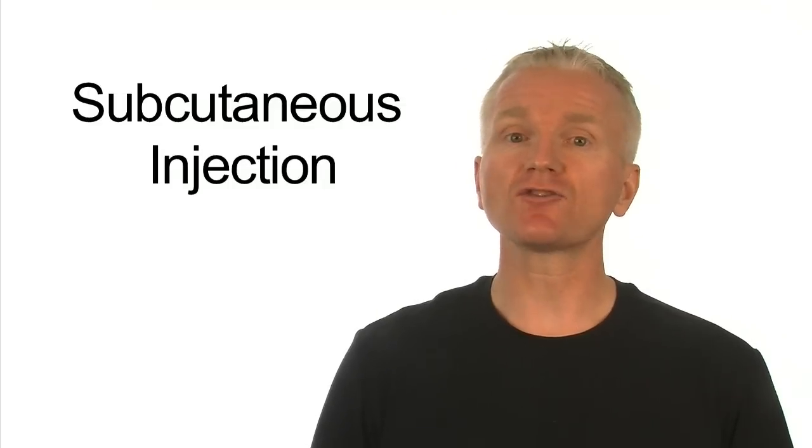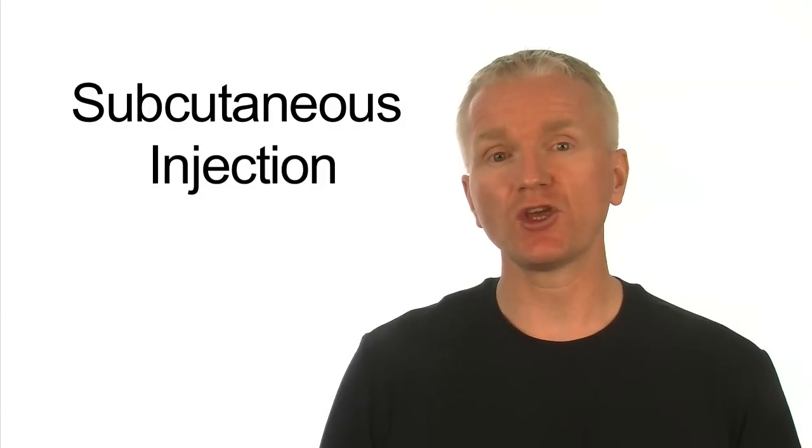Today, we're going to teach you how to perform an injection under the skin using an auto-injector. This is also known as a subcutaneous injection or sub-Q injection.